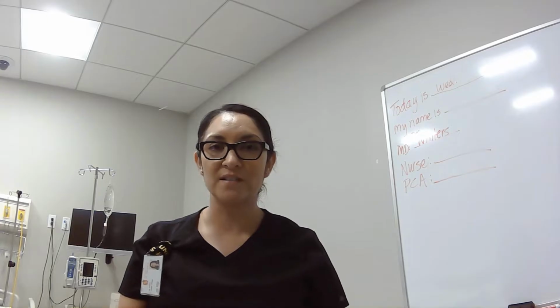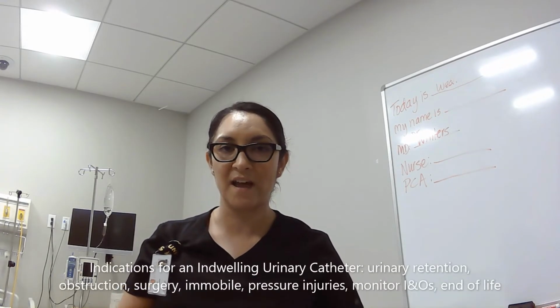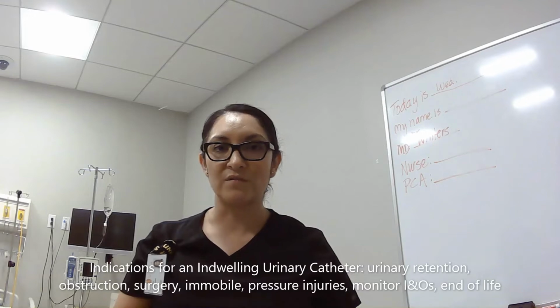Today's skills that we're going to cover are Foley insertion and removal. So when your patient needs a Foley inserted, an indwelling urinary catheter, it's due to several things.